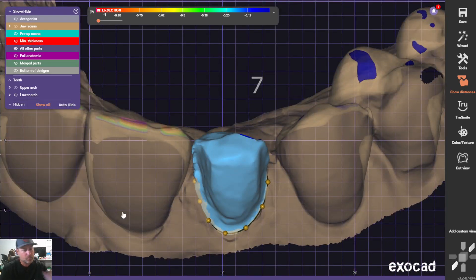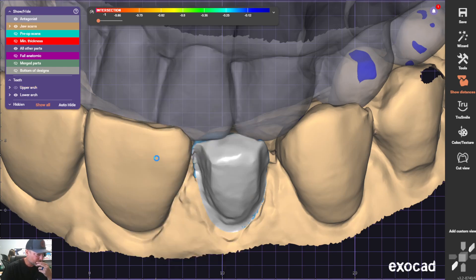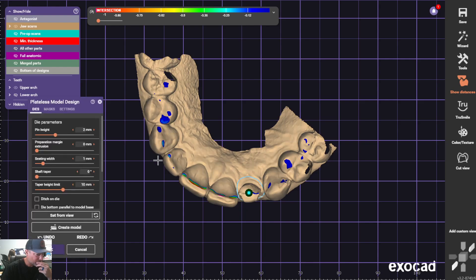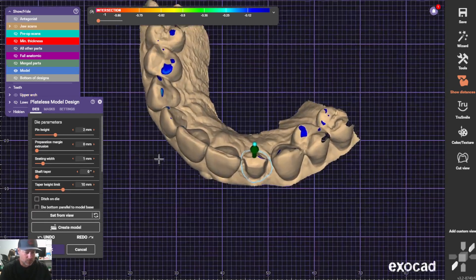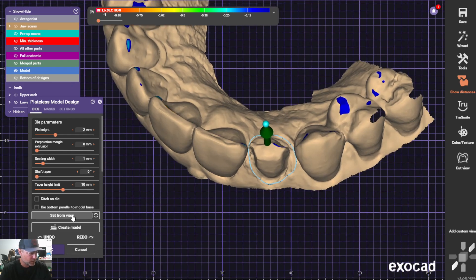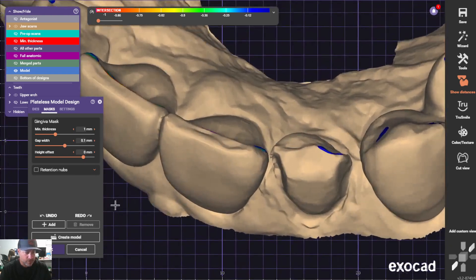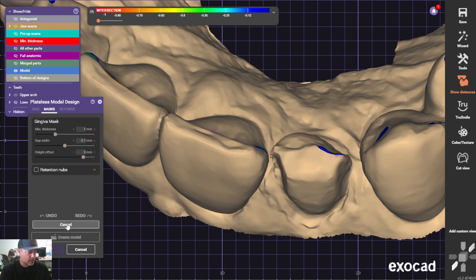Hit okay, then go to model design and set our insertion direction. Now what I did here is I chose a mask and just hit Remove. We're basically adding a gingiva mask — just hit Add — then mark your margin where you want to start ditching around your die.